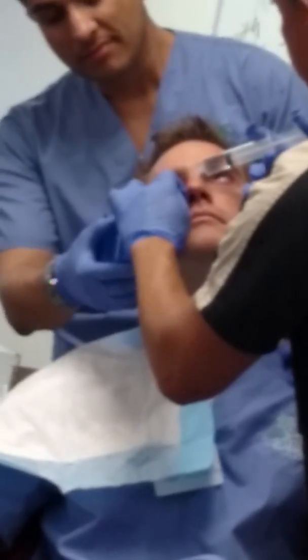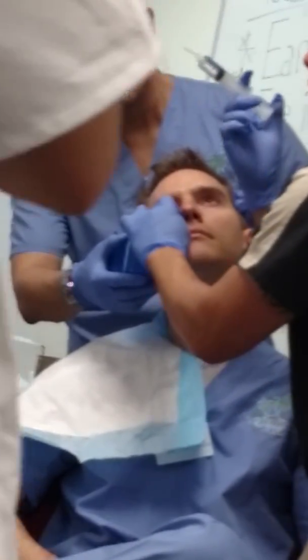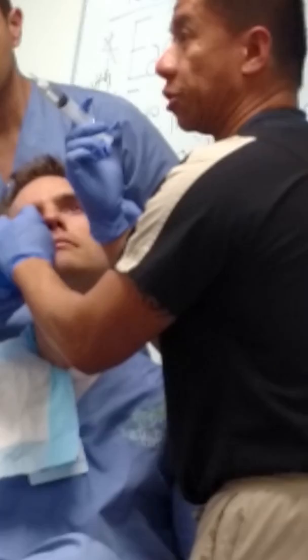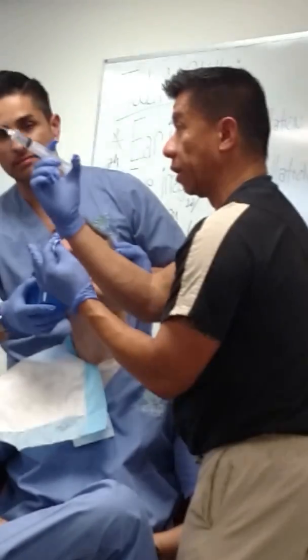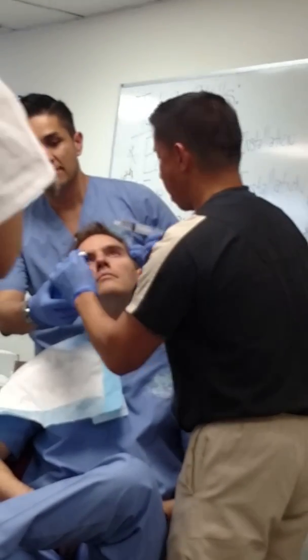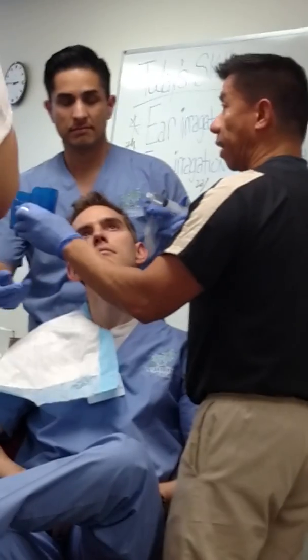So from in, out. Are you guys with me? And you have the control. If you do it really strongly, then you will injure the patient's eye. So you pretty much adjust based on how comfortable you are holding this syringe. All right. Now, any other questions? You watch for any foreign bodies being dislodged after the irrigation.